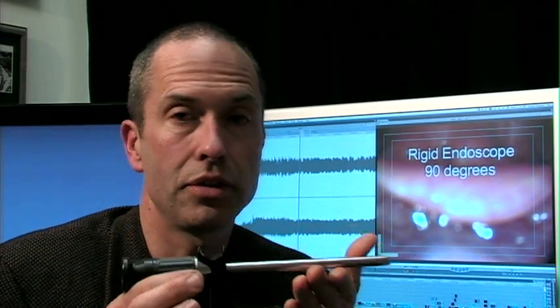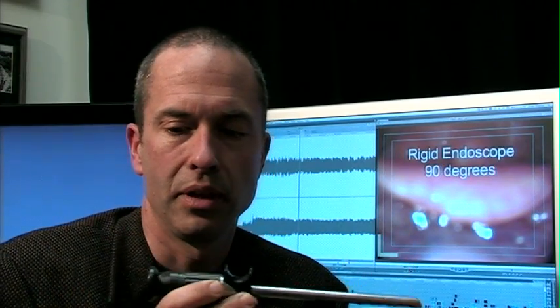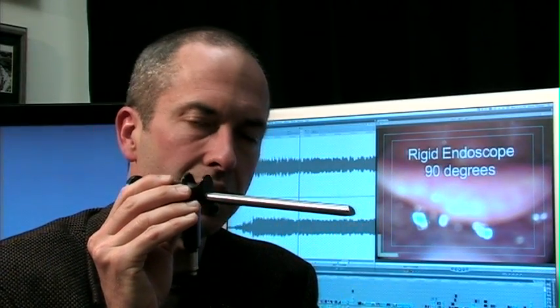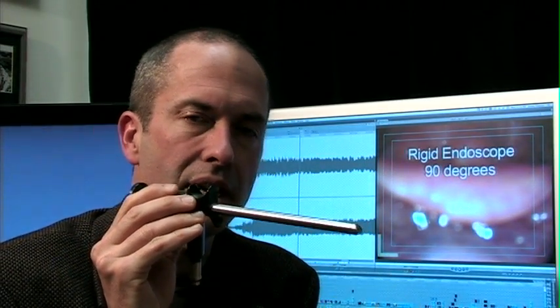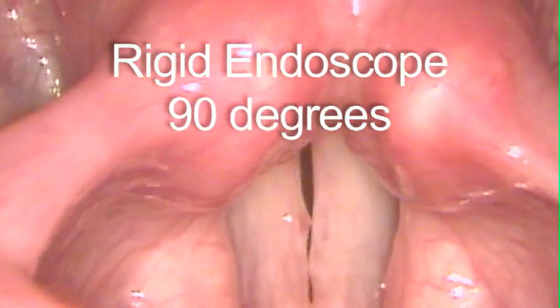Laryngology has come up with at least three different types of endoscopes, which can be incredibly useful. First, the German engineering rigid Hopkins rod endoscope. You look in this end and the image is a 90-degree image. The light shines down this way — a very clear image — and we'll talk about some of the pros and cons to this style.